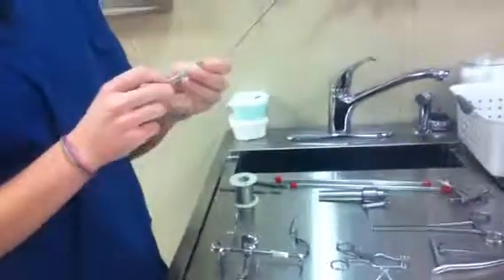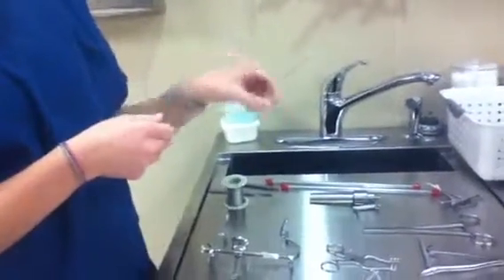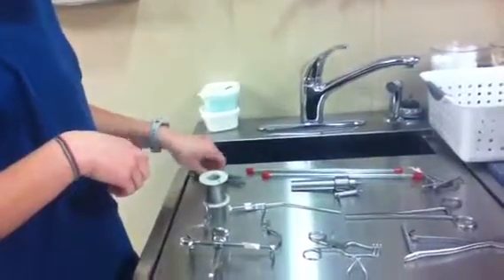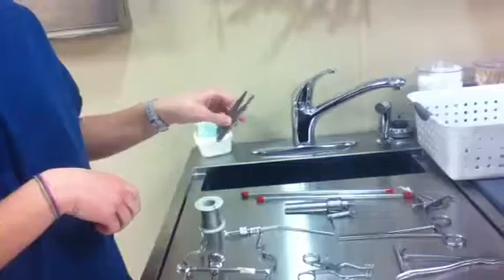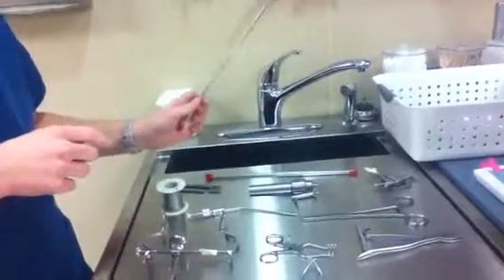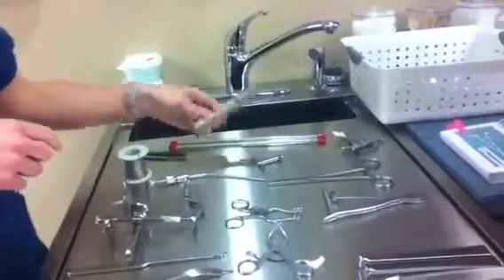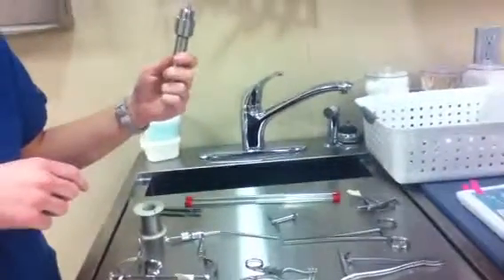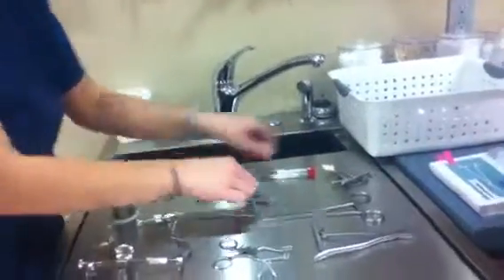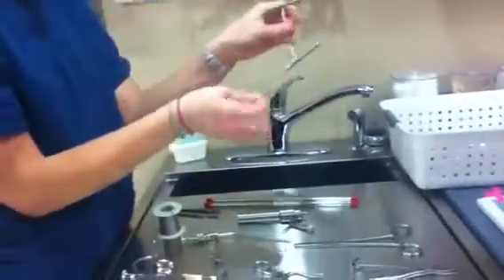Frazier suction, or something like that. Wire — orthopedic. Scalpel blade holder handles. The IM pins, Jacob Hand Chuck and Key.